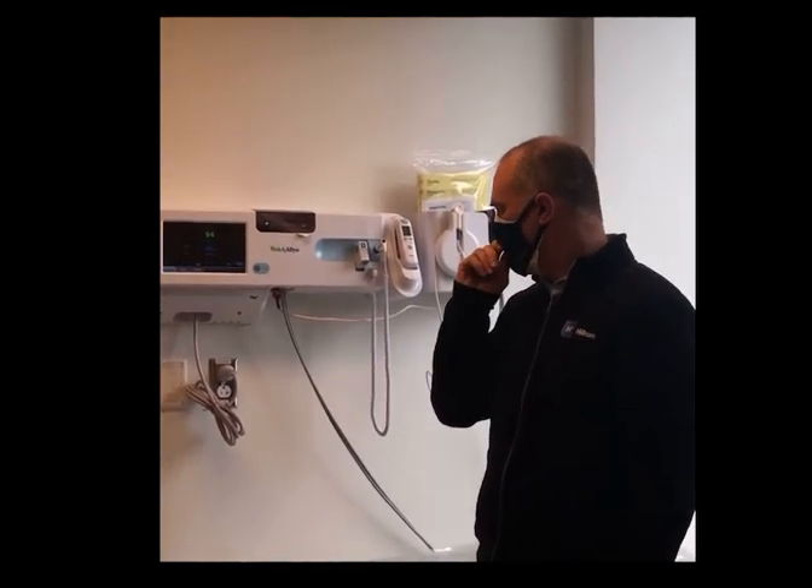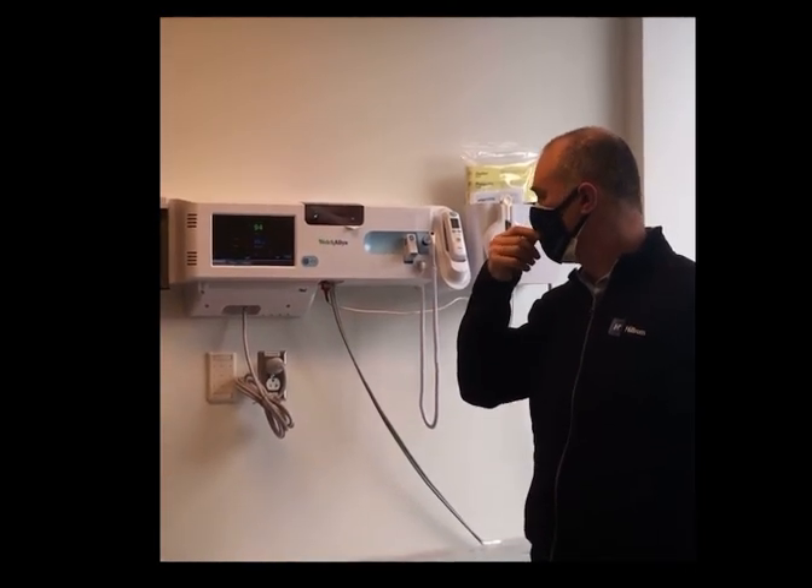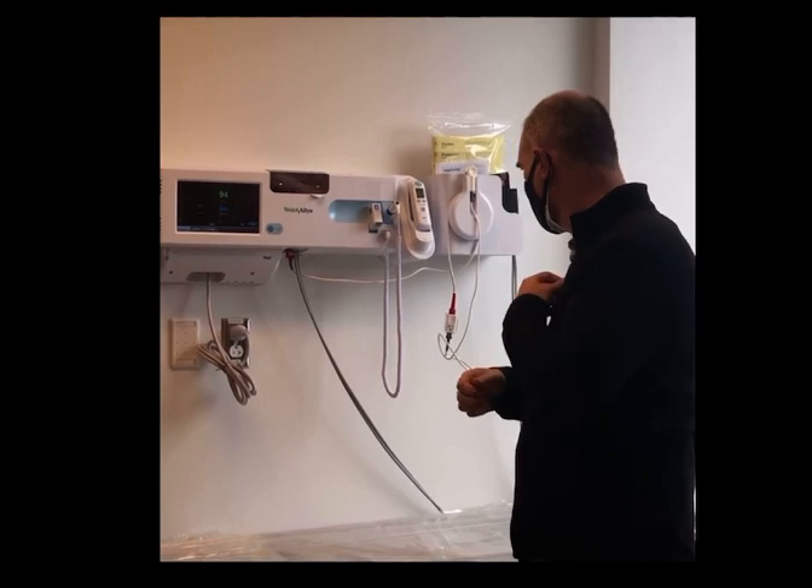Okay, so temperature — we've seen it, although we cleared that out before — and then the blood pressure. Let's go back to the blood pressure, if you guys don't mind.